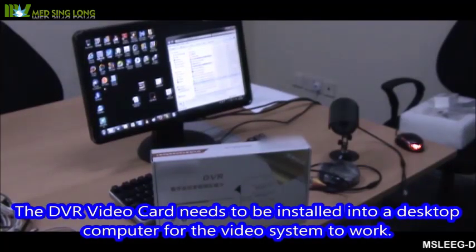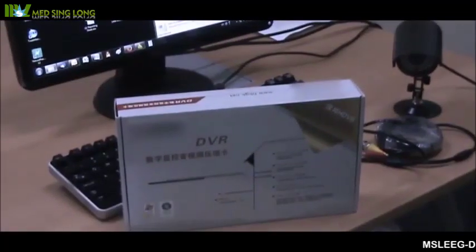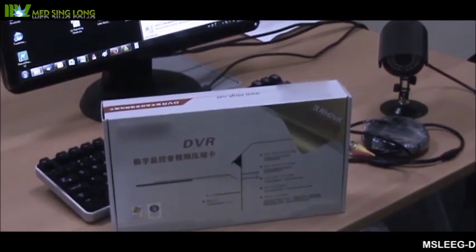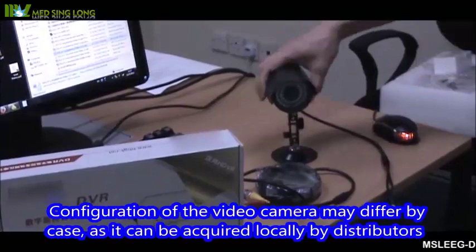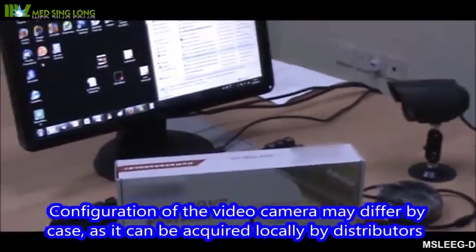The DVR video card needs to be installed into a desktop computer for the video system to work. Configuration of the video camera may differ by case, as it can be acquired locally by distributors.